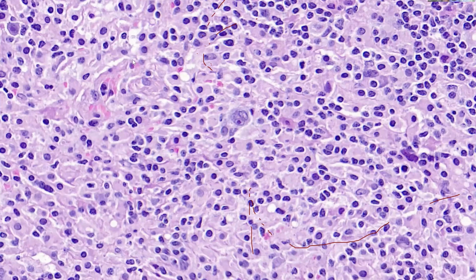They are obliterated. And if you zoom in on any of the areas, you find these cells. The Reed-Sternberg cell is highlighted by very prominent nucleoli, and the background is a mixed population of cells. There are lots of histiocytes, lymphocytes, some plasma cells, and isolated eosinophils as well. So this is a typical feature of mixed cellularity Hodgkin lymphoma.